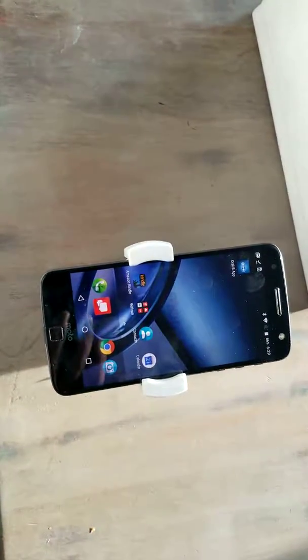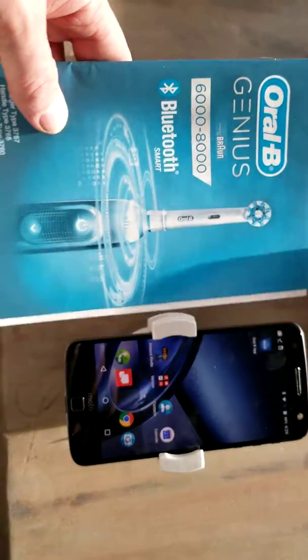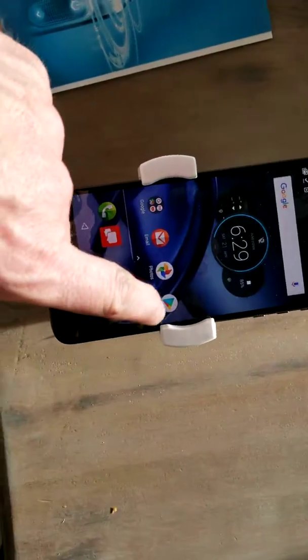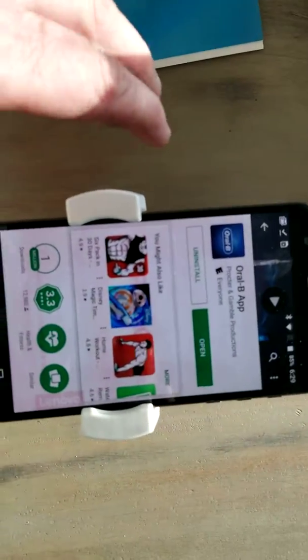In this video, we're going to talk about the app for the Oral-B Genius, because I have the 6,000 to 8,000 series. So I went ahead on my Android device, went over to the Play Store, and downloaded the software. It's the Oral-B app.